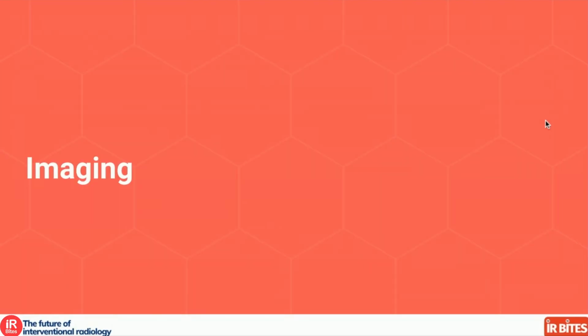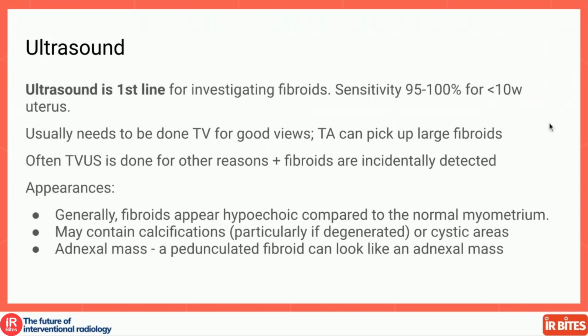Cool. So we'll go on to the main imaging methods for fibroids. Yes, it is ultrasound, which is the first line, and it has a very high sensitivity for picking up fibroids.